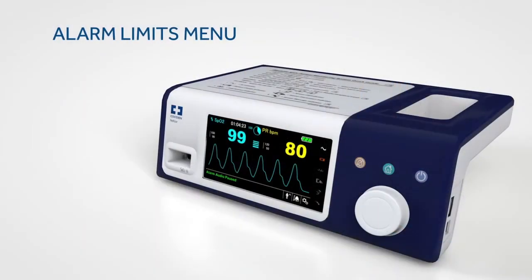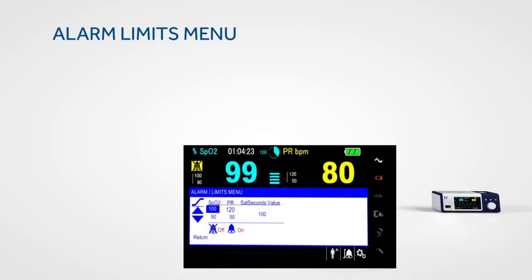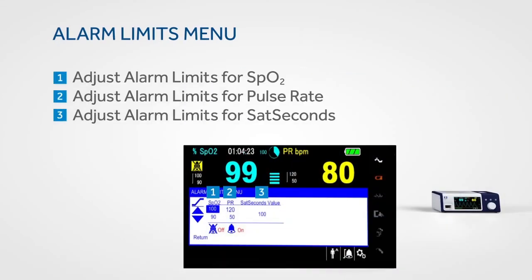To access the Alarm Limits menu for SpO2, pulse rate and sat seconds, rotate the jog dial to highlight the Alarm Limits display area and press. The Sat Seconds Alarm menu allows you to adjust settings to minimize clinically insignificant alarms that occur with your patient.